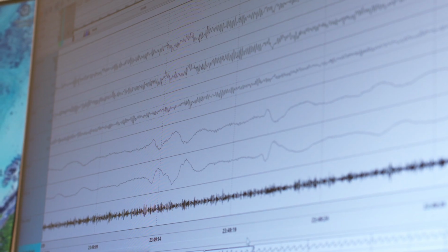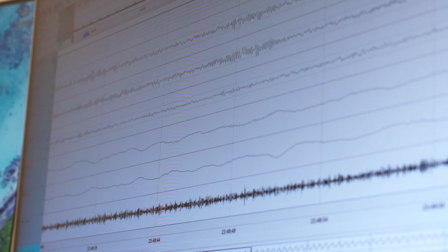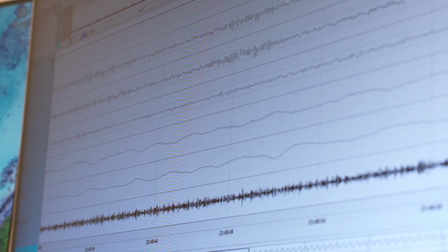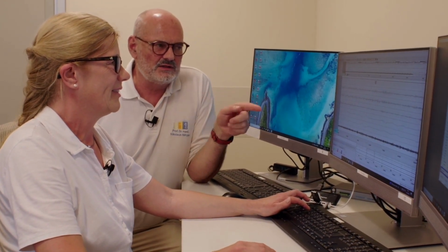Exactly. And here we see beta waves, which are faster than 13 hertz. Hertz just means the oscillation per second. And now I'm pressing awake, awake, awake, and look. But just briefly, actually, because we had this explained during our studies. So hertz means it's alternating current, yes, like from a power outlet, just not with 50 hertz like our outlets, but here, when awake, and that's the normal state in the brain when we're awake, 13 hertz.